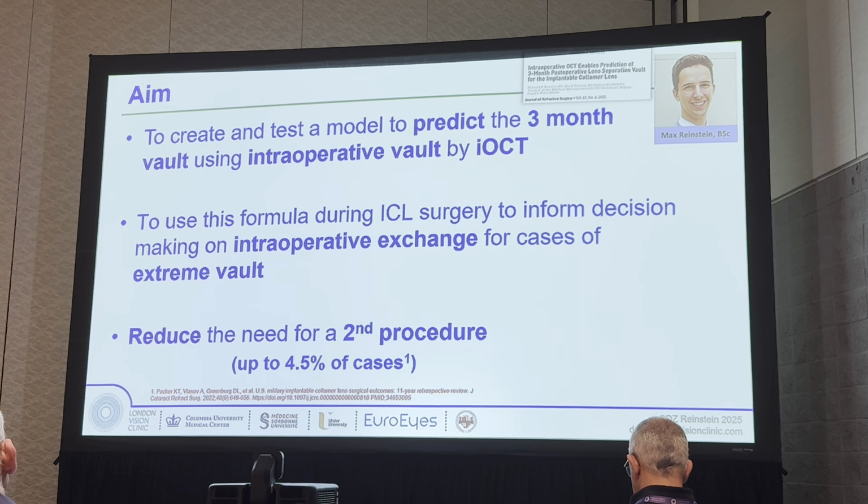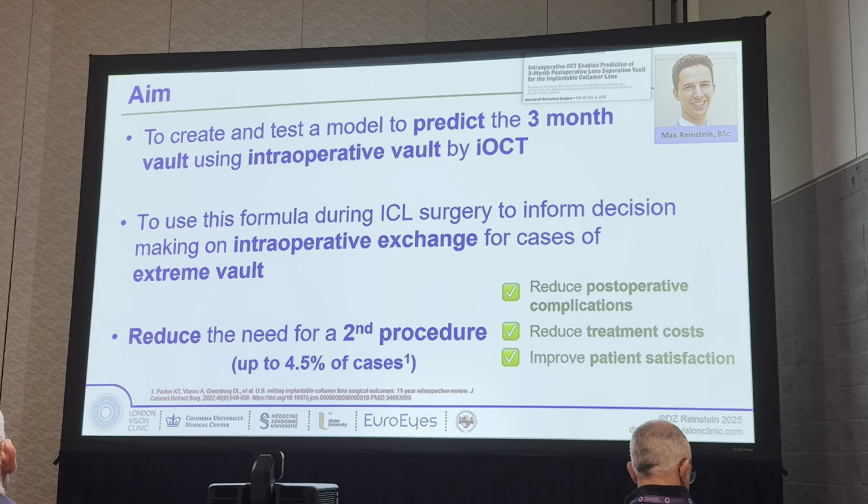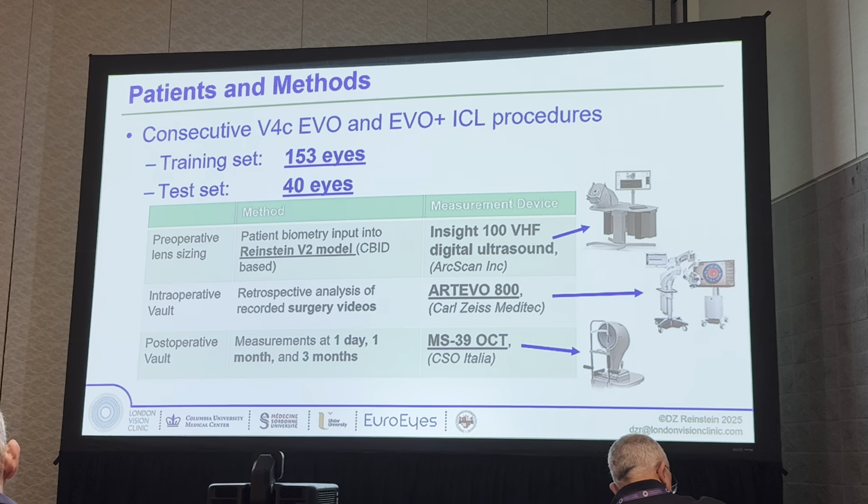This would reduce the need for a second procedure and ultimately reduce postoperative complications, reduce treatment costs, and improve patient satisfaction.